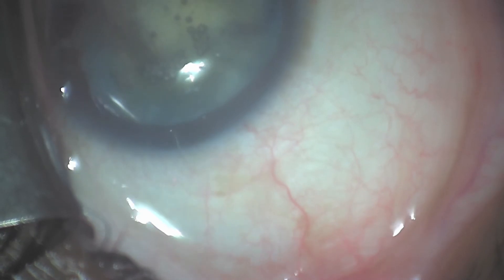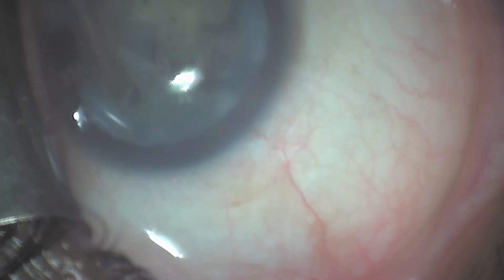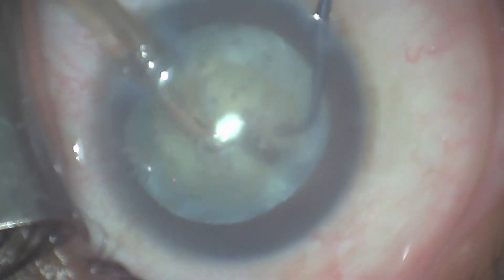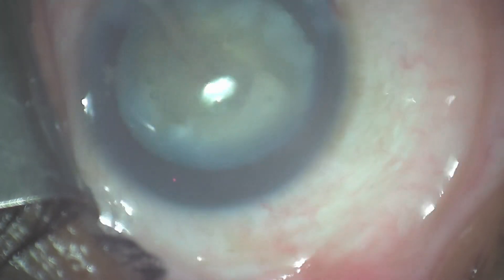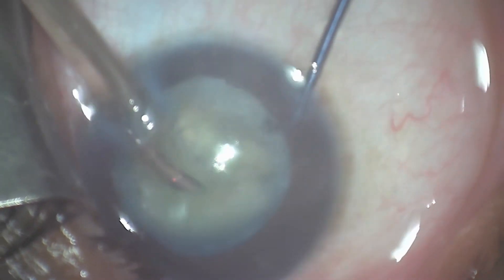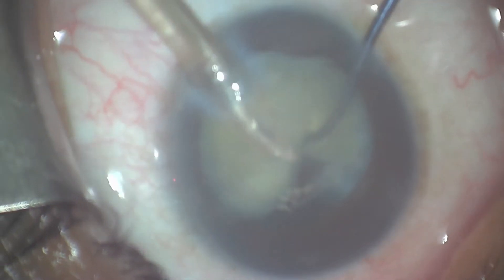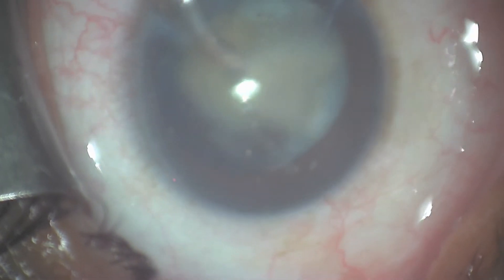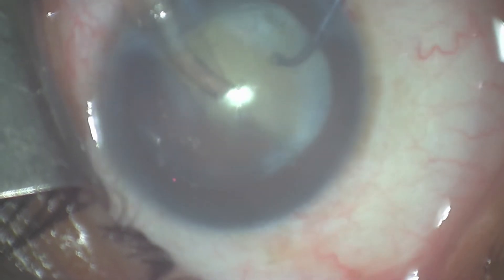Now you can see we've got a beautiful capsular rhexis. We've emulsified and sculpted down in the lens, and this very dense lens was still able to be cracked. I will subsequently aspirate the lens into the center of the anterior chamber, and in so doing, that allows me to emulsify the lens well away from the cornea, but also in a safe zone, well posterior in the posterior chamber.